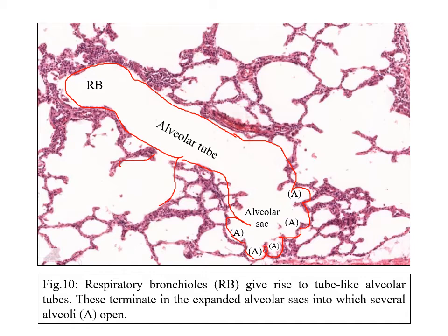Now all these alveolar ducts, alveolar sacs, and alveoli are simply lined by simple epithelium. Smooth muscles are very few, and most of the time they are even absent. Mostly we have elastic and reticular fibers surrounding the alveoli, but we cannot see them clearly in the slide.